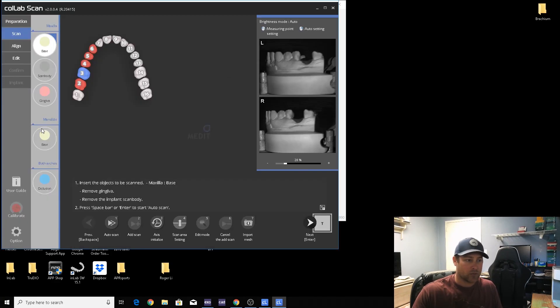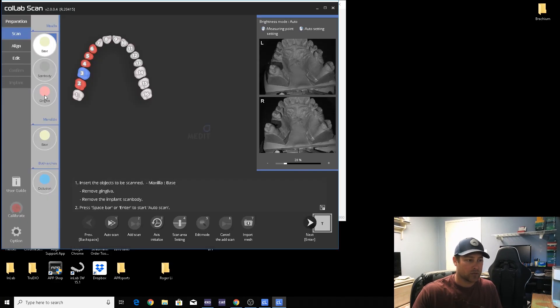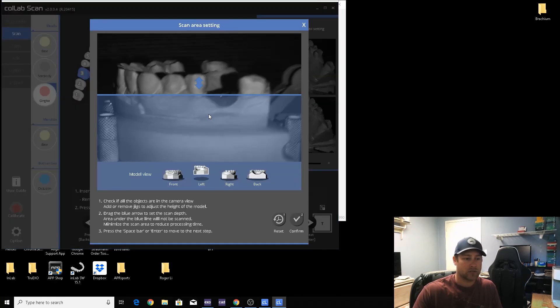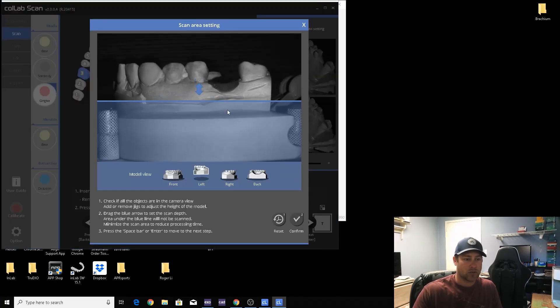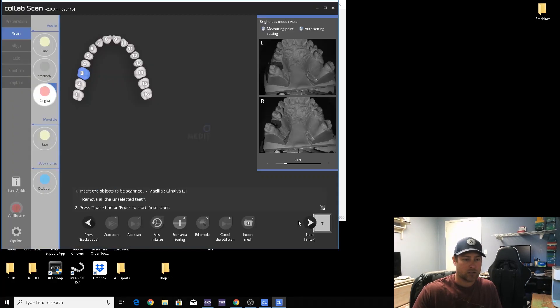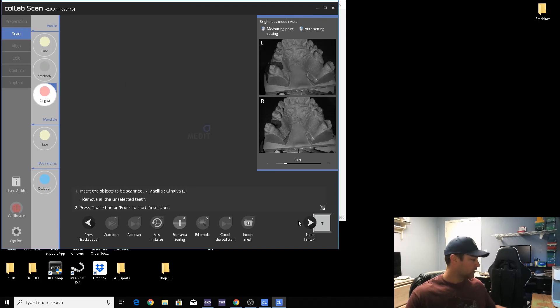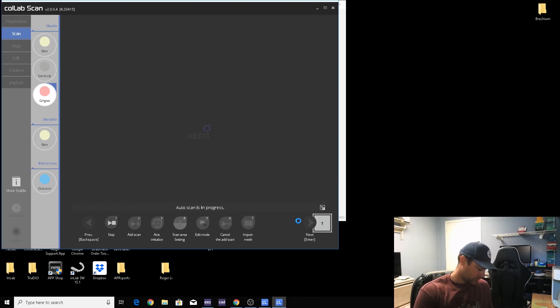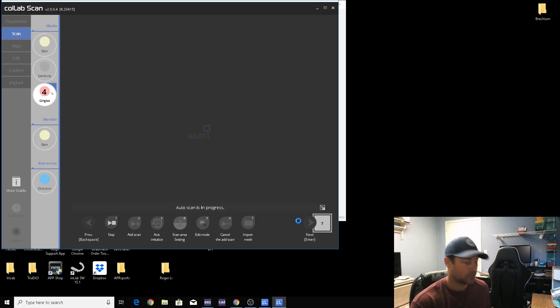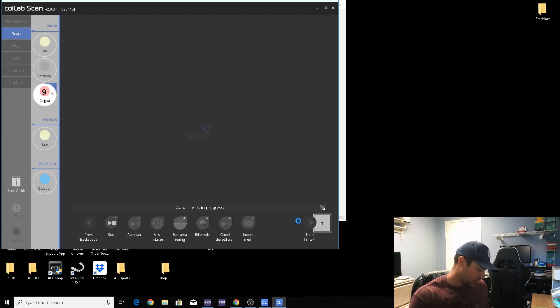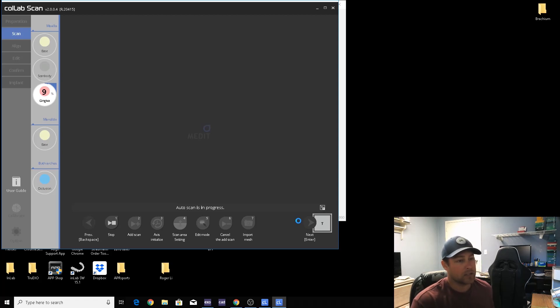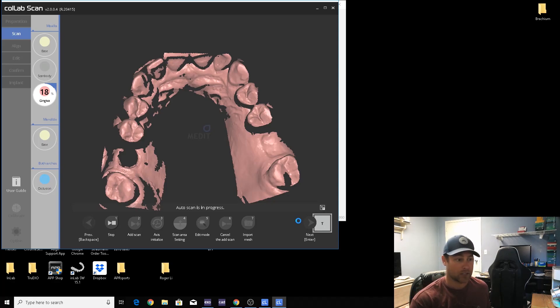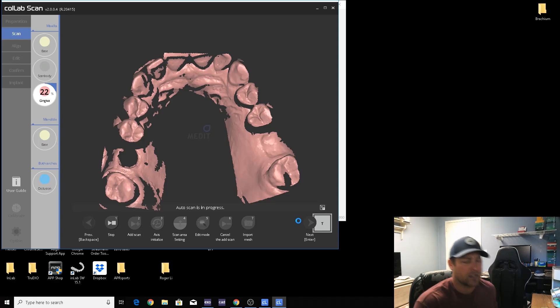I can switch it over to scan gingiva first. Go ahead and get that started. While I'm waiting, I'll go ahead and clamp the closing model.